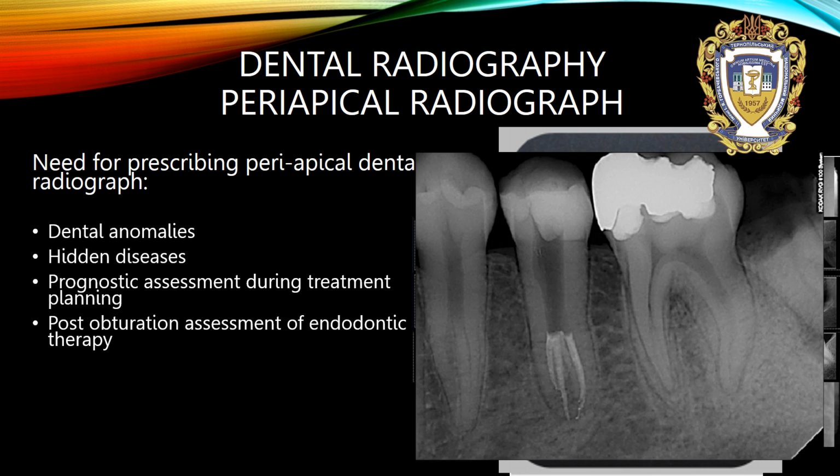Of course, this work was done under a microscope. You cannot do this treatment only manually.